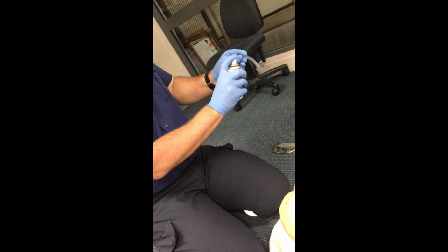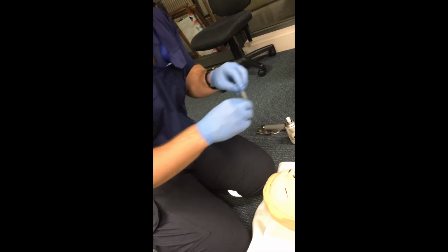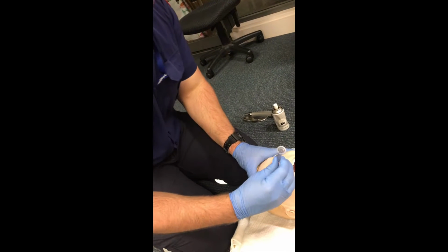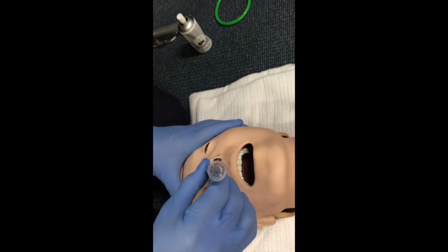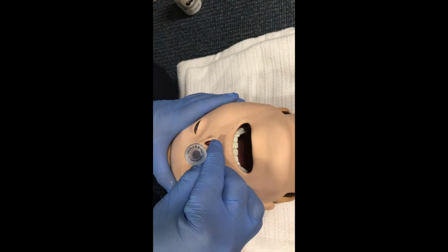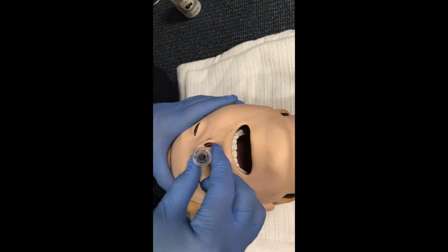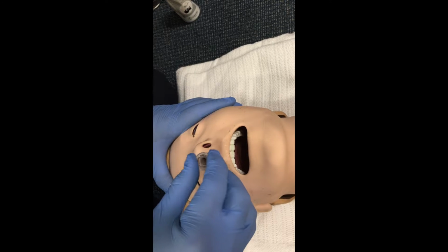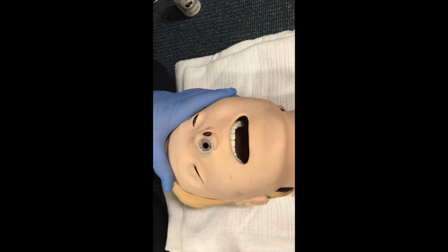When inserting the NPA, push the NPA into the chosen nostril at 90 degrees to the patient's face. At this stage, if there is any resistance, stop, do not force, and pull out. Here we advance the NPA, rotating clockwise and anti-clockwise 45 degrees whilst inserting. If there's any further resistance at this stage, re-lube, try another nostril, or select a smaller NPA.